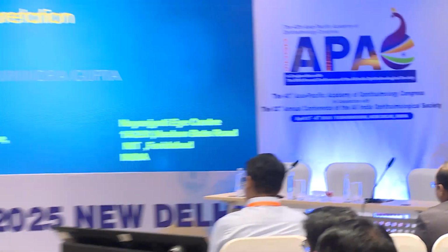So we'll start off with our IC on OCT angiography, and the first speaker would be the chairman of the session, Dr. Avninder Gupta, who is a senior vitreoretinal surgeon from Faridabad and Delhi, and he would be talking about introduction to OCT angiography and interpretation. How do you go step by step on OCT angio?